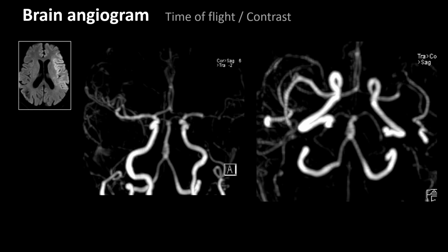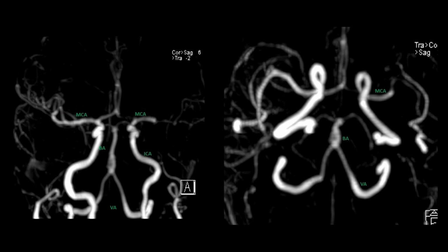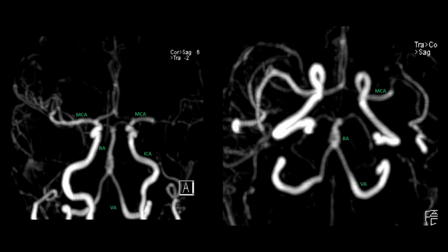Then we perform a brain angiogram. This is the anatomy. We have both the vertebral arteries, which join to form the basilar artery, which gives the PCAs or the posterior cerebral arteries. Then we have the internal carotid artery, which gives the middle cerebral artery and the anterior cerebral artery.